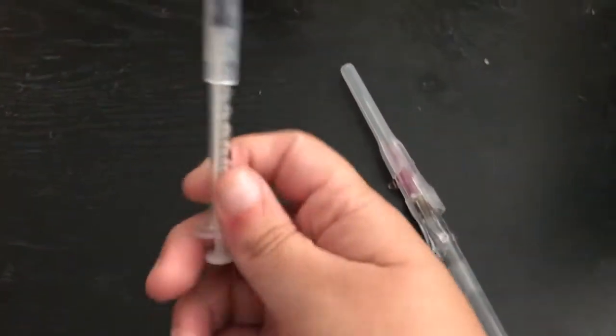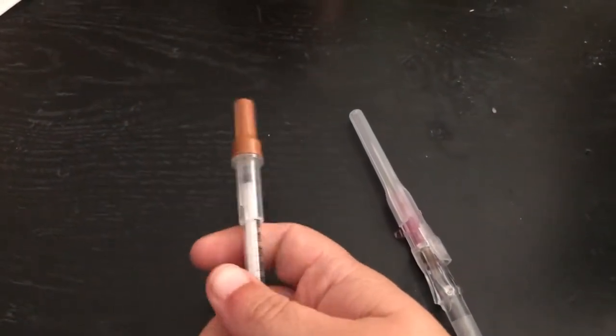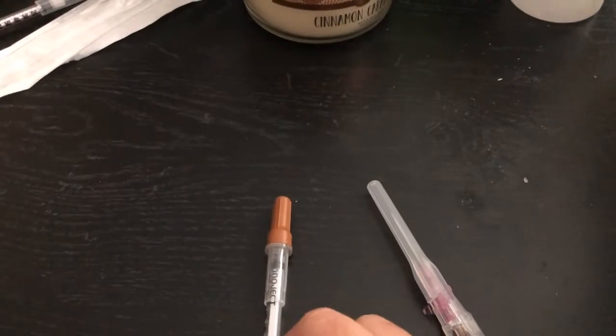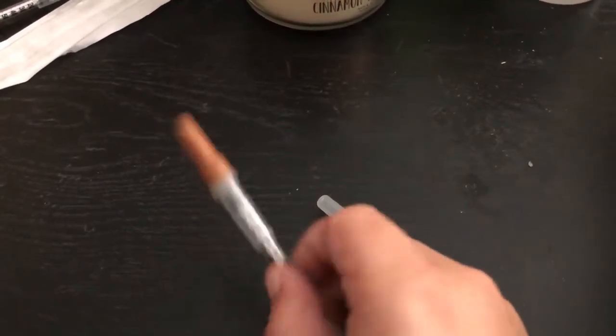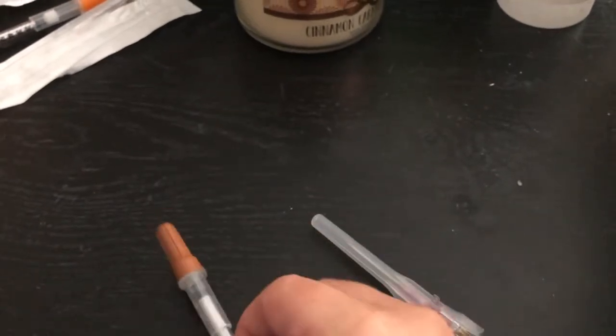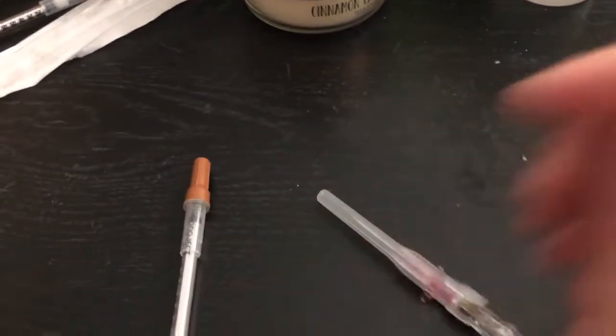But when you're doing that, I feel like you could still get an accidental needle stick if you are putting the needle into this cap and then lifting it up and still putting the cap on. It still puts you at risk. So just be careful whenever you're handling needles.